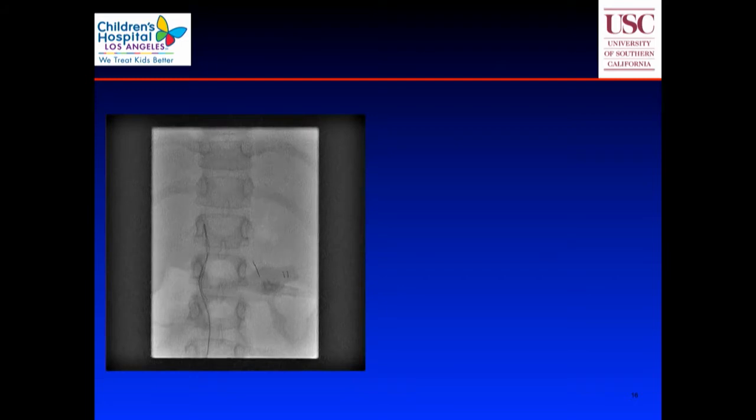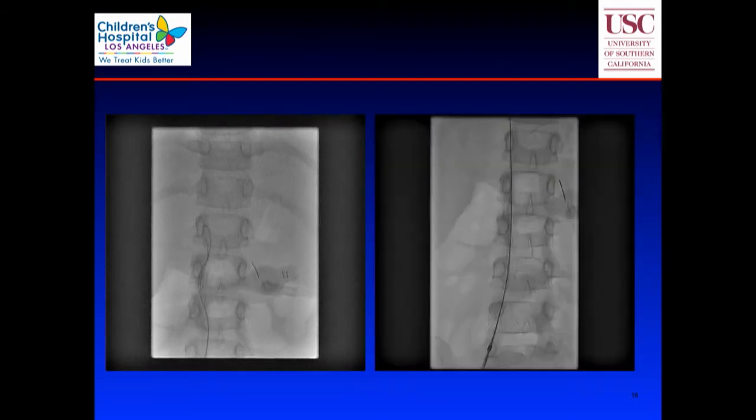So we're sort of trying to make our way up to the inside of the vessels, up towards the heart. And again, finally, we get to a part where you can see some normal flow up on top at 12 o'clock.